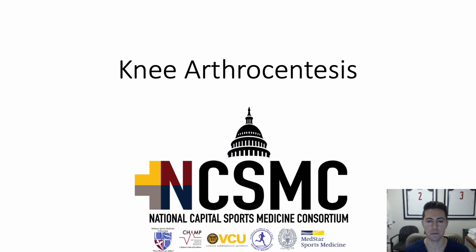Hello. Today we're going to talk about knee arthrocentesis. The general approach for arthrocentesis of any joint is roughly the same, but today we're going to discuss and practice knee arthrocentesis.